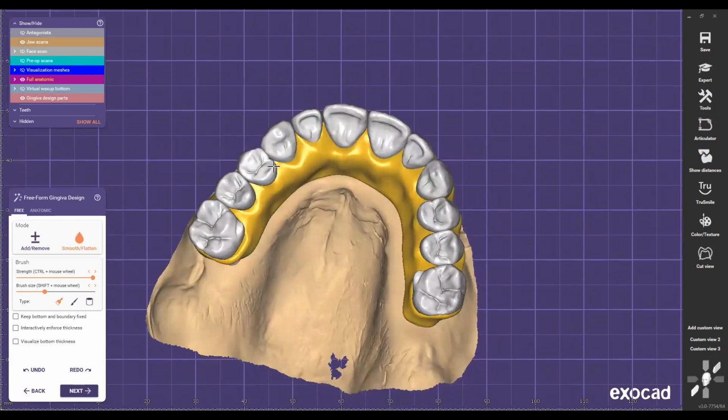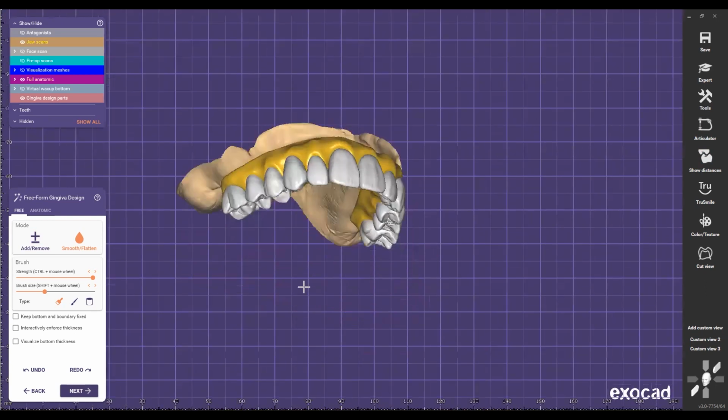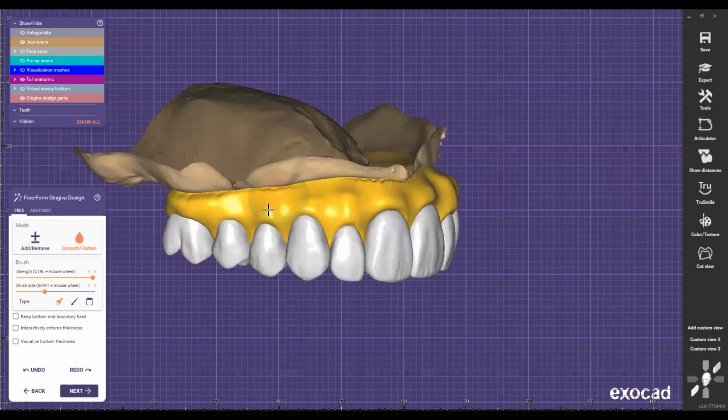Once you start seeing those videos, it just makes sense what you're doing here. It makes everything so much easier, much more fun, because you think, oh, okay, I know where this technique is coming from. Once you see that, it's like, oh, I thought I was not doing it right. But when you see those videos from analog wax and all that, this makes much more sense to you. So it makes it easier to understand this technique.